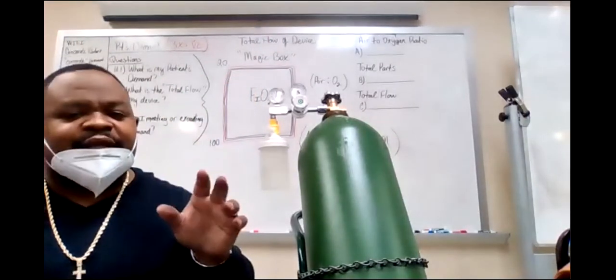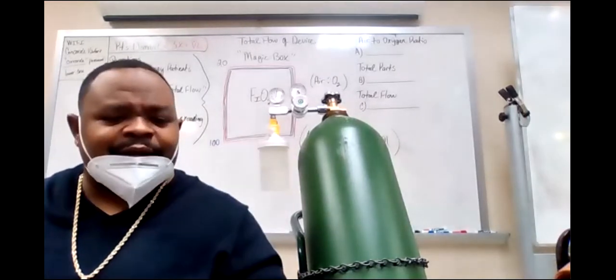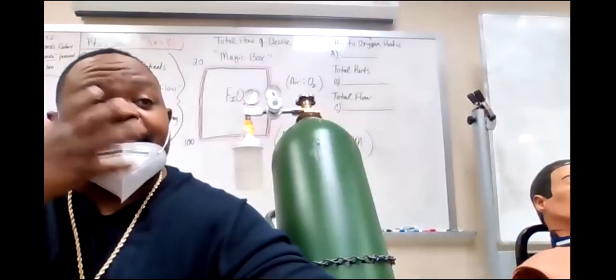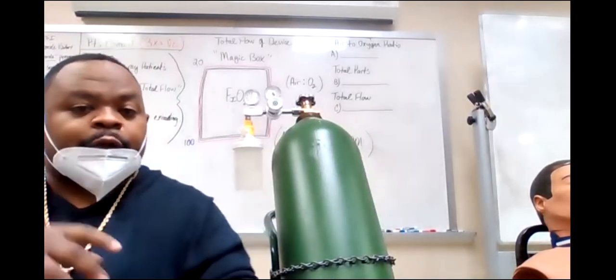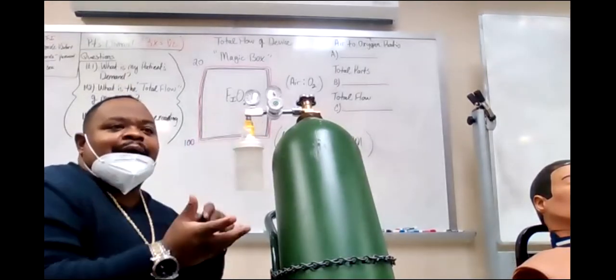So you think of yourself, put some water on that, right? Just like I said, I put water on everything. If you're blocking that air, if you're bypassing the upper airway, you need to put some water on that, okay? Most definitely. Now, notice how you see it coming out, right?